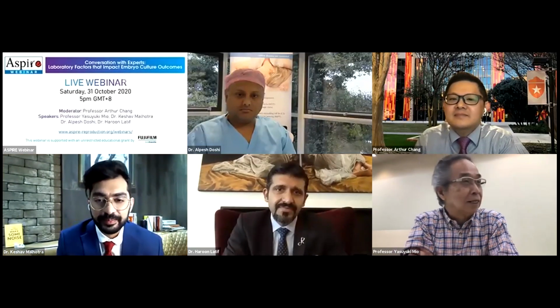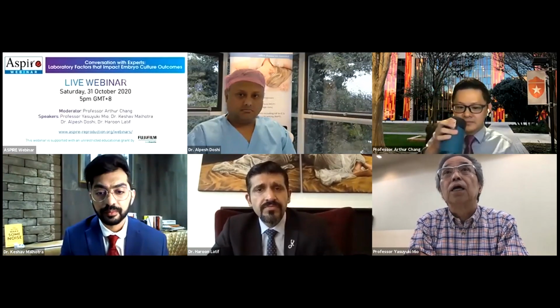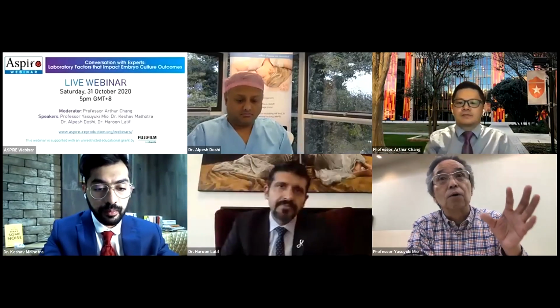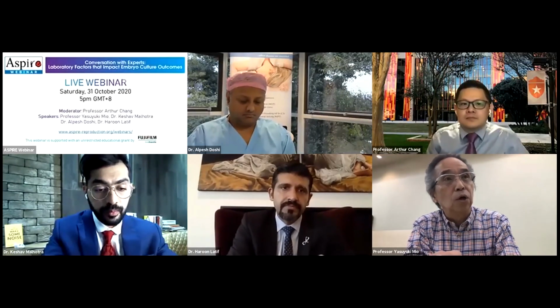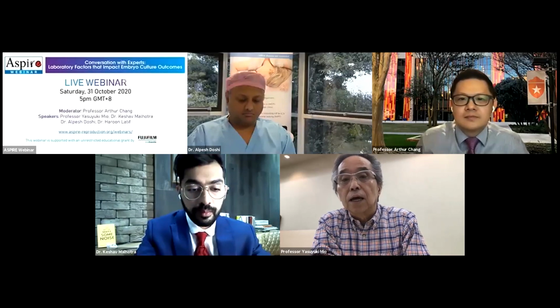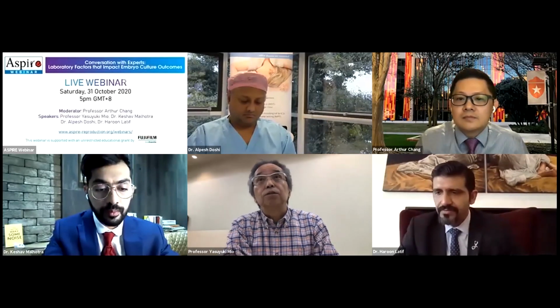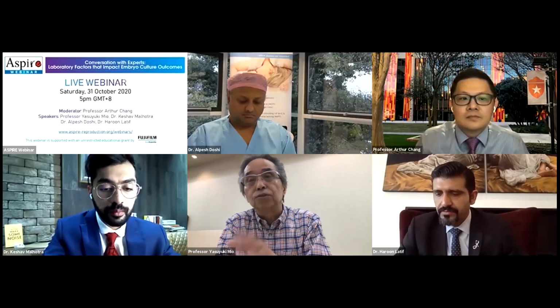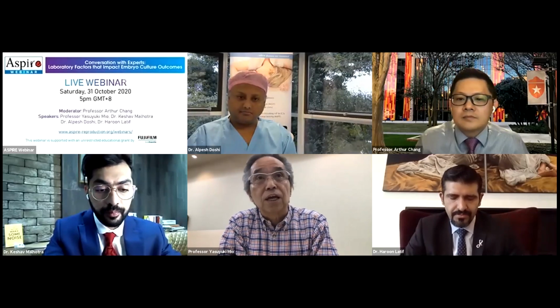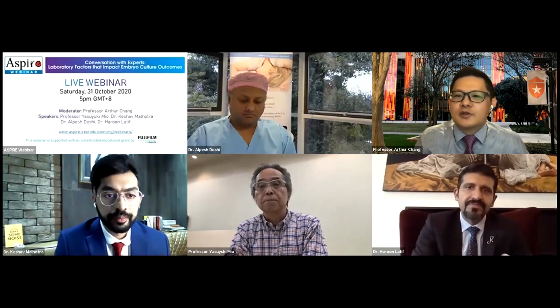Yeah, I don't know exactly, but so far we have checked the relationship between oil type, several types of oil, and osmolality rise. I've never checked the CO2 penetrating through oil into the culture media. I have not checked yet. Thank you, Professor Mio. And that could be another research topic for the audience.